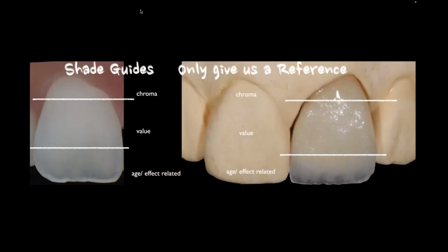So really critical is how you take those shades, or how you photograph that information. But let's remember, it's a reference. What is it a reference to? The reference that a shade guide really does for us is it gives us the basics of nature, and how I break nature down is the same way over the years. The cervical area is where you always have the highest amount of chroma. The middle third of the tooth is where you get the most value in your tooth, and the incisal edge is where you'll see the most either translucency or effect or mamelons or secondary dentin, and all of that is depending on the age related to that tooth.